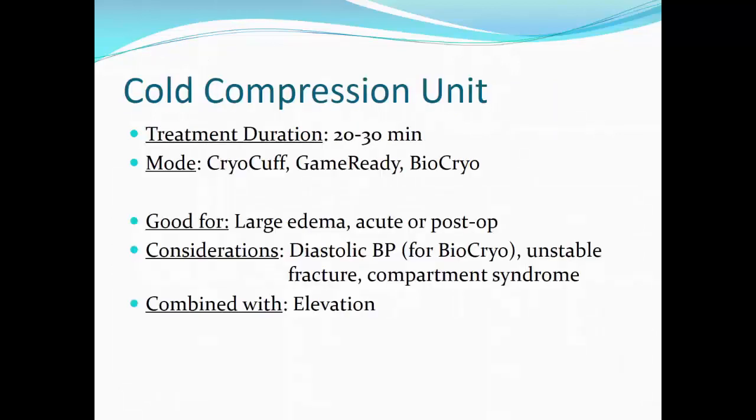Cold compression units are the combination of chilled water to provide cold and compression simultaneously. Cold compression therapy units are good to use with active inflammation, acute injury, pain, or chronic pain. Indications include swelling, acute injury, chronic injury, and edema. Contraindications include open wounds, circulatory insufficiency, anesthetized skin, deep vein thrombophlebitis or DVT, cardiovascular disease, allergies, and sensitivities to cold. In addition, body type or fat distribution may also be a contraindication depending on the target tissue.